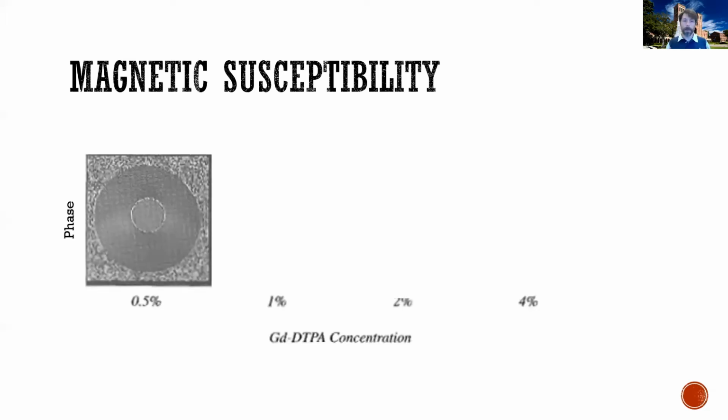So this is an image of exactly what I showed you a moment ago, just seen from above. This small circle is that little central cylinder, the little pipette, that white cylinder that I showed earlier. So this is the blood vessel. And this is that gray cylinder from the previous slide, which is essentially a small piece of brain tissue. Right? So it's the exact same image, we're just looking at it from above.